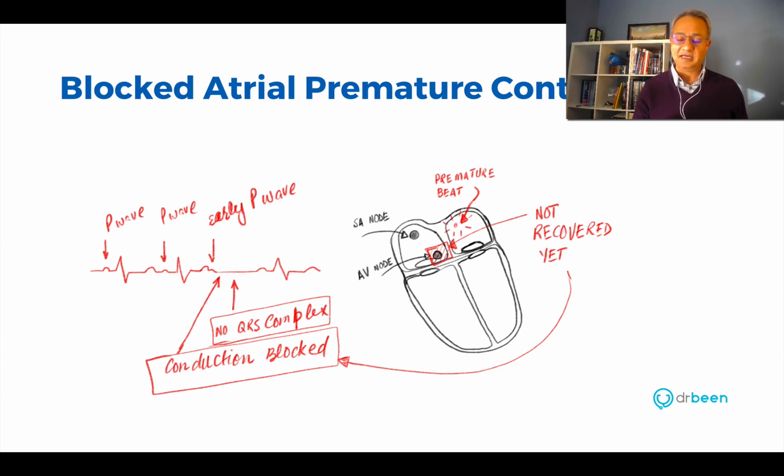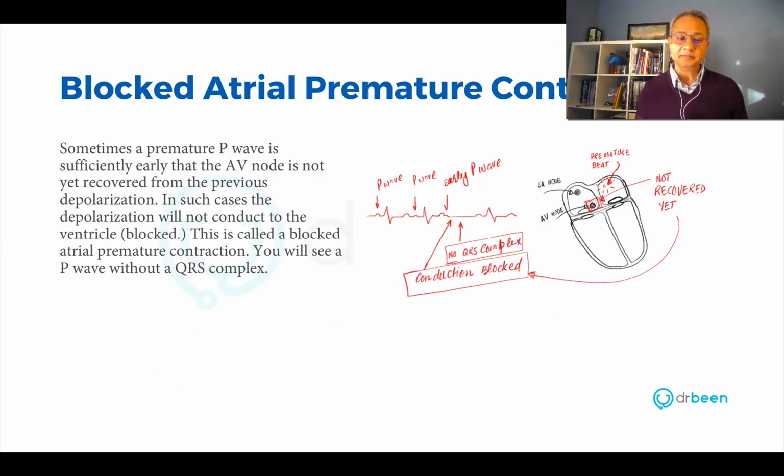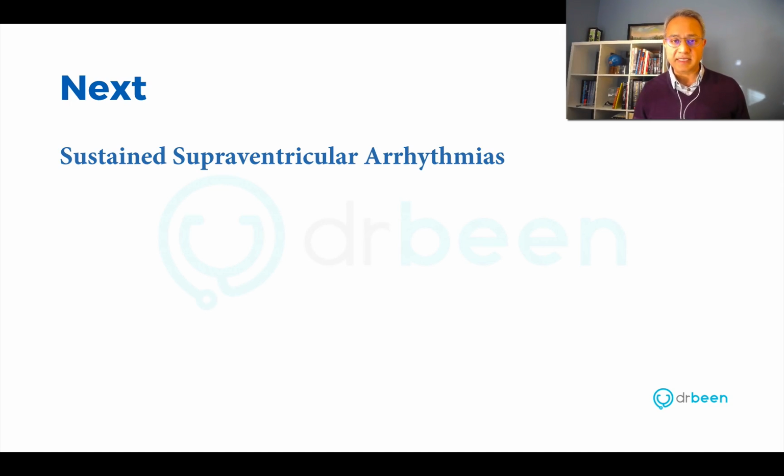And who blocked it? The AV node. So once again, this is the explanation. You can read this if you like. It is the same thing as I discussed. So this is what we have for this lecture.